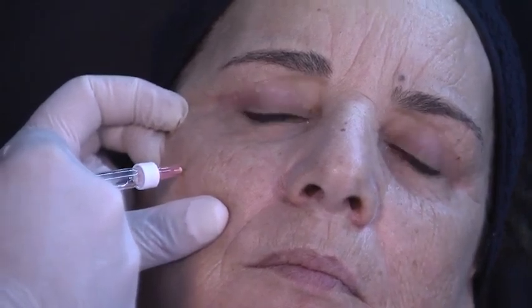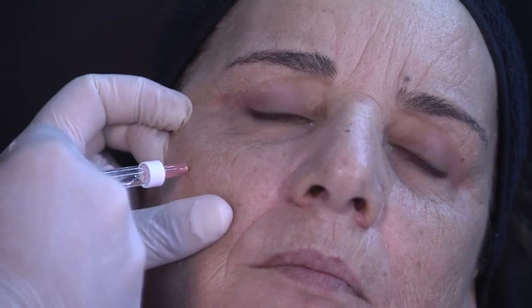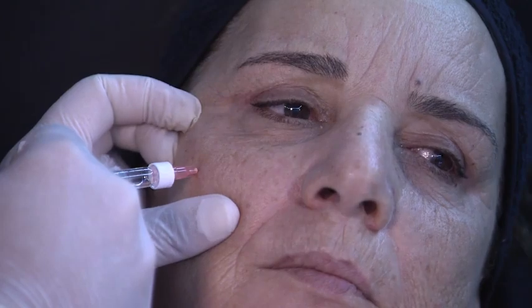With my needle, I touch the bone, and then I go slowly. I want 0.35 here, or 0.3.